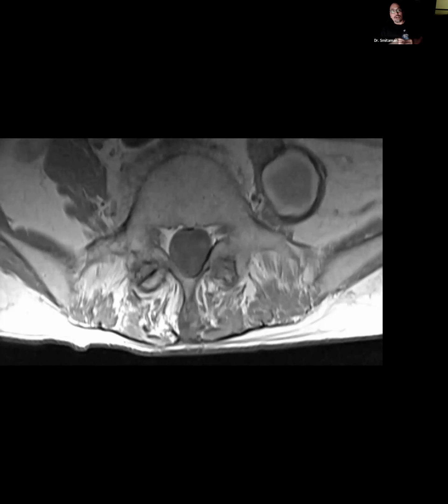Hematomas can occur from trauma or anticoagulation therapy. Again, comb through the chart, look for the INR, coag profile, see if it's elevated or out of whack. Can present commonly in the psoas muscle, as we know, but the other location, as we know, is the rectus abdominis muscle. MR imaging appearance can vary depending on the stage of the blood products and degradation products.